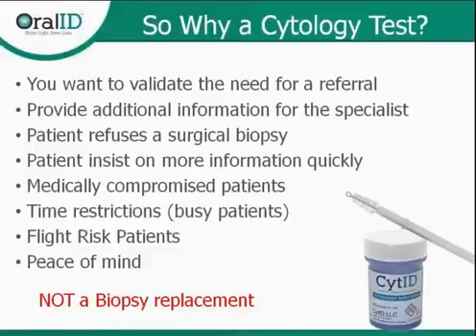If it were my mouth, and somebody's seen something that was kind of like, well, it doesn't look too bad, but it looks dark under my light, and I'm just curious what it is, we can go two routes. We can either take a little sample of the cells, or you can go to another doctor and have a section cut out. What is your option? I mean, everybody would say, let's go the non-invasive route first, see what that says, and then we'll determine if it's beneficial to go the next step.